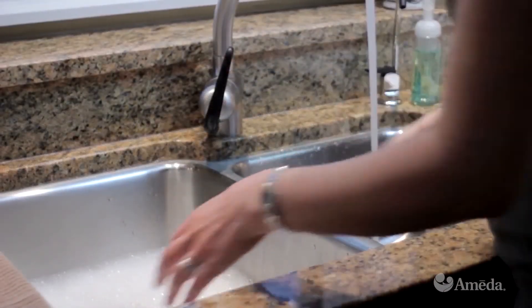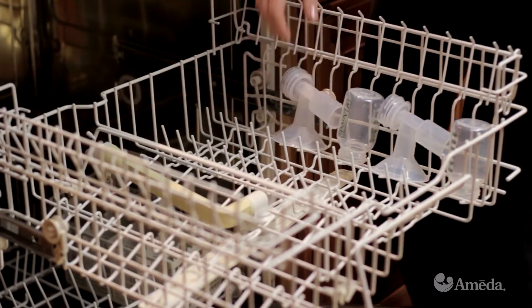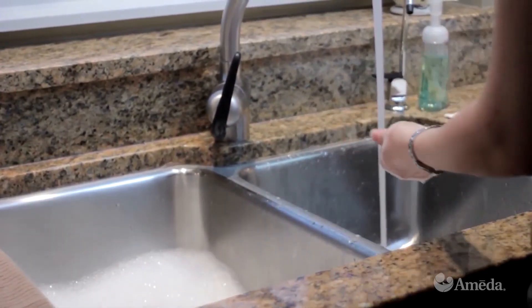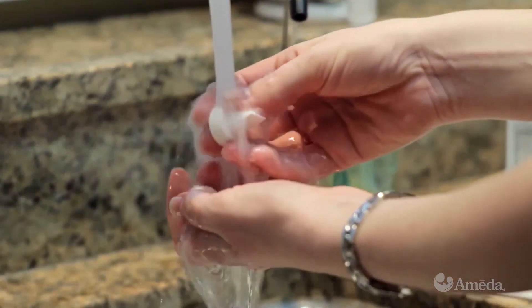The bottles, flanges, and any inserts may be washed by hand or on the top rack of a dishwasher. The silicone diaphragms and valves should be washed only by hand in warm, soapy water and rinsed well.